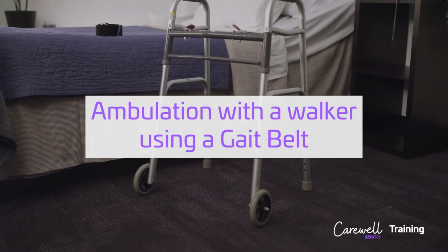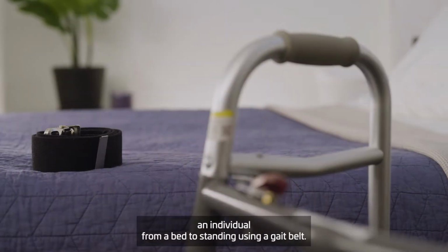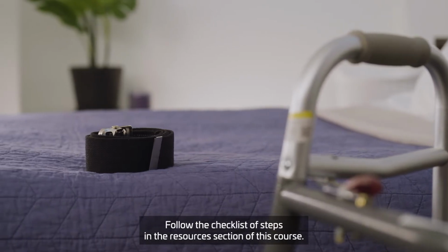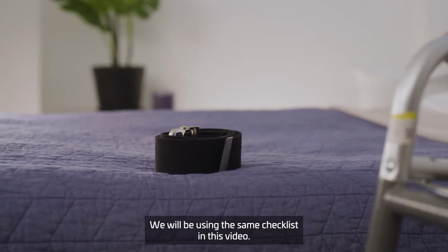Ambulation with a walker using a gait belt. In this video, we will demonstrate how to assist an individual from a bed to standing using a gait belt. Follow the checklist of steps in the resources section of this course. We will be using the same checklist in this video.